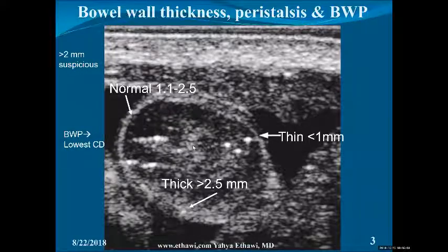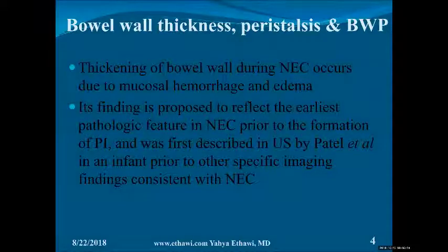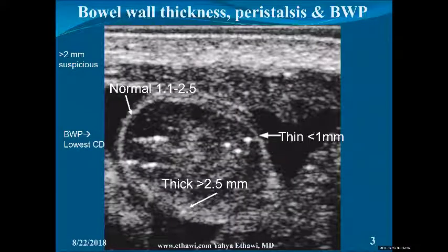Okay. So I can see the normal and the abnormal all in one. You can see all in one, usually not the whole wall, unless the whole wall is sick, which is a very late sign. But most of the time you don't see it all in one bowel wall. Okay. And it's best to do the assessment when you take a cross section of a bowel. Because when you do ultrasound, you'll see the bowels in cross section, in oblique, and sometimes in longitudinal section, because they're moving in different directions. So just try to measure the thickness in a cross section of the bowel wall.